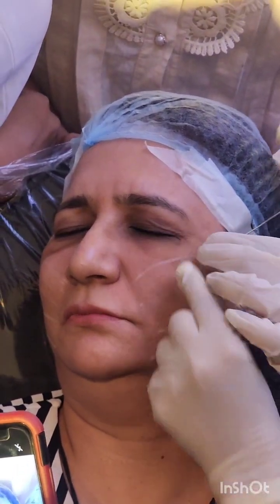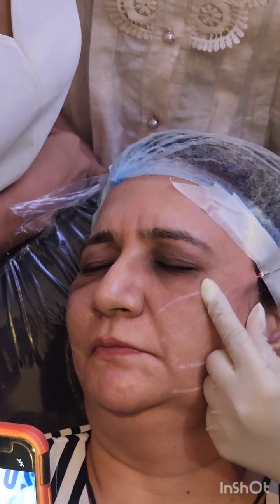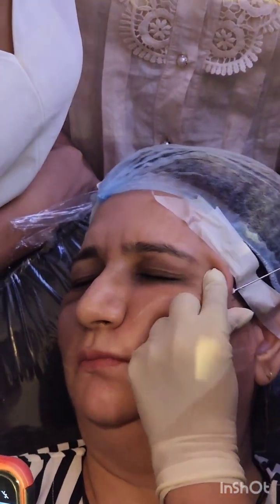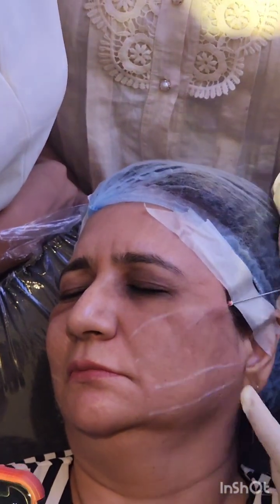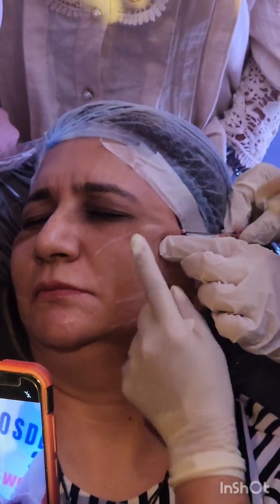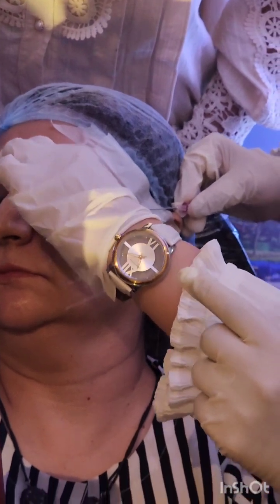Put little pressure. Is it hurting, ma'am? Sorry. If it's hurting, just come back. But little pressure. It's not that easy. If the patient has scarring from acne or something, then you may feel little resistance. Can you lift the skin? Yes, it's right. Ma'am, little bit of traction you will feel, not much.